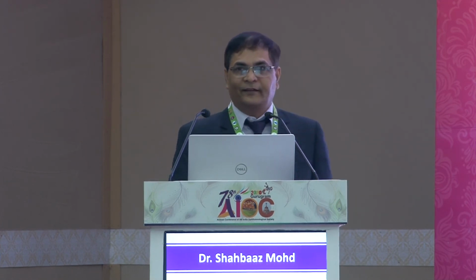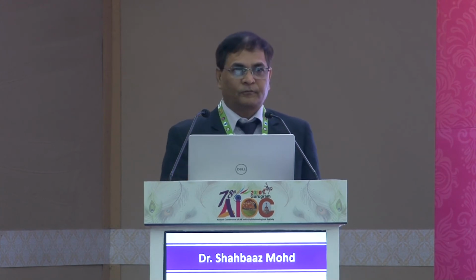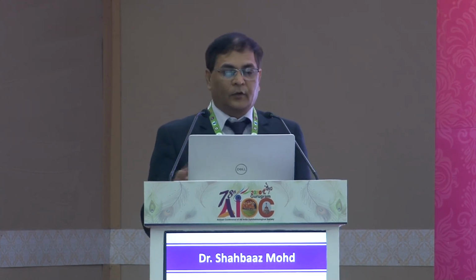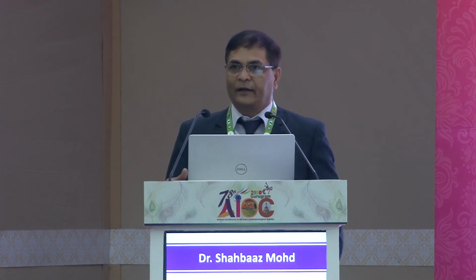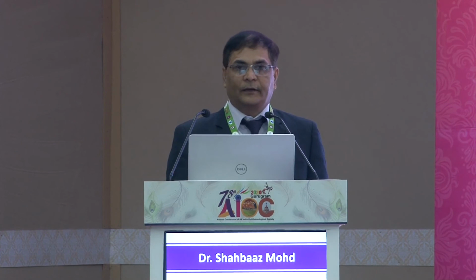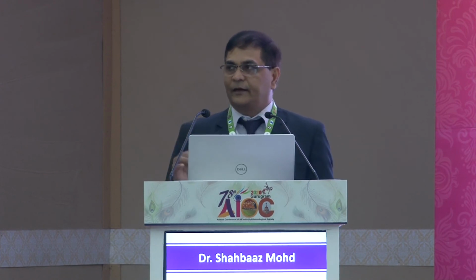So the next thing in this is keratometry. We have a manual keratometer and an automated keratometer. Most of us are now using the automated keratometer, which is easier and nowadays reliable also. But if you have to do manual keratometry, then it is important to ask the patient not to put any eye drops inside the eye.